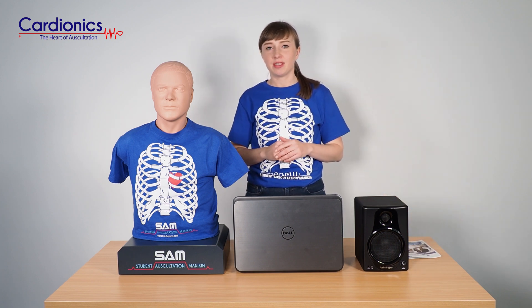If you're interested in finding out more about SAM2 or any other Cardionics Auscultation Training solutions, please visit our website or contact your local sales representative. Thank you.